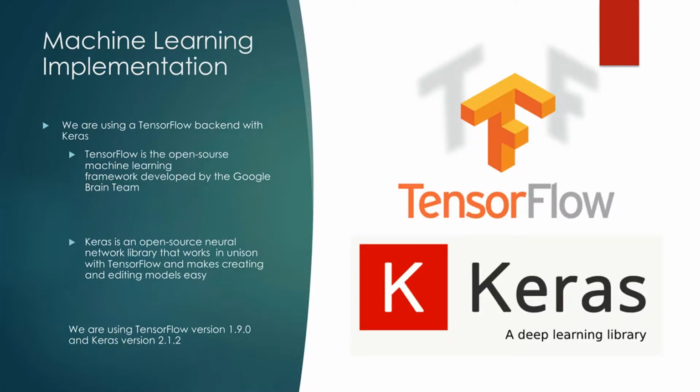So for our machine learning, we are using a TensorFlow backend with a Keras frontend, and we include the version that we're using on the bottom of the screen there in case you're curious.